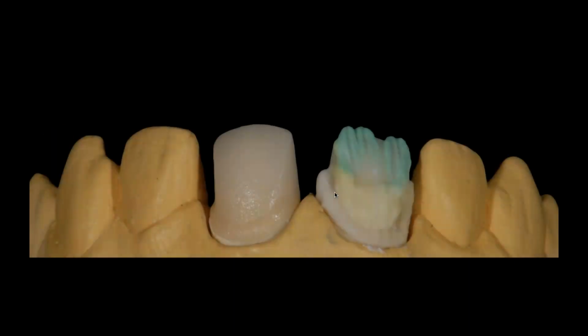For those of you who know me, I don't normally use C and D shades. I'm of the belief that there really is no such thing as a C and D shade. And without going into a long diatribe, I won't explain that too much more at this moment, except to tell you that even though I don't believe in them, I don't utilize them very often. There are times where I might cheat and use a little bit of a C or a D shade.